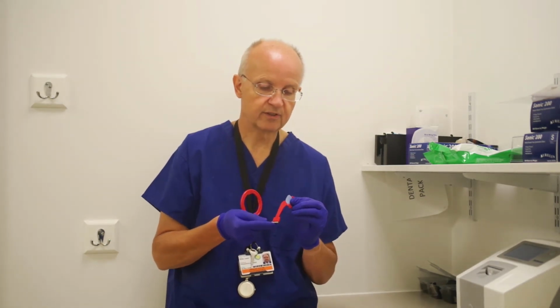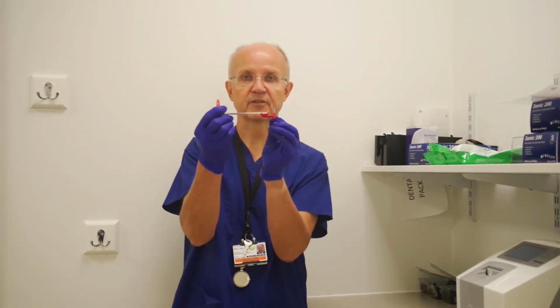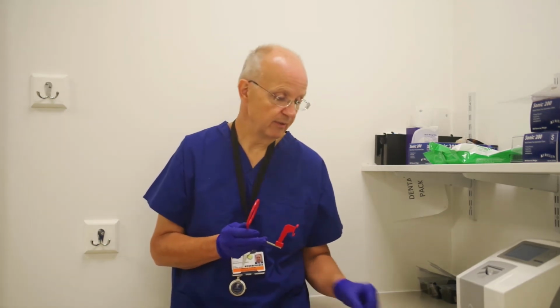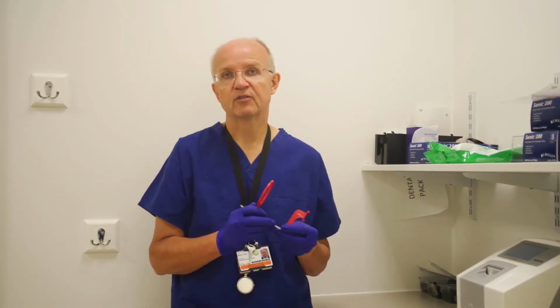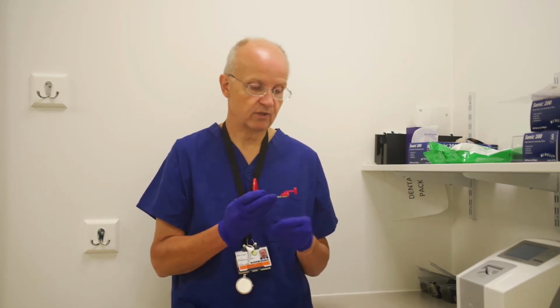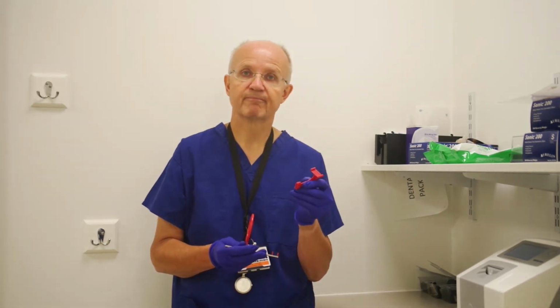I've got one for a size 0 here, but you can see that it's just very, very slightly different. And again, when you open up your packet, setting up for a bite wing, just make sure that you've got the correct one. The one that you're going to be using most of the time is the horizontal bite wing, and you'll be using them for both adults and children, so make sure you've got the right size and it is going in the horizontal direction.